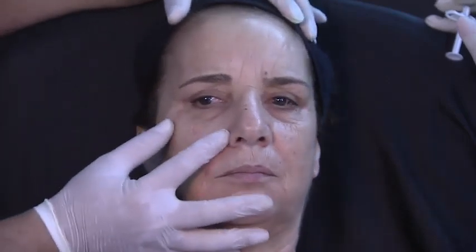And by using needles or cannula. No, in this area I prefer cannula, I need safety. Do you have any reservations of which direction the opening is, up or down or lateral? You mean the bevel up or down? Yeah. No, if I am under the muscle, it doesn't matter if I go with my bevel up or down. I don't think it plays any difference. My product is all going to be under the muscle. Makes sense. Yep. Do we have a needle? 25. Could we have the camera zoom out just a little bit?